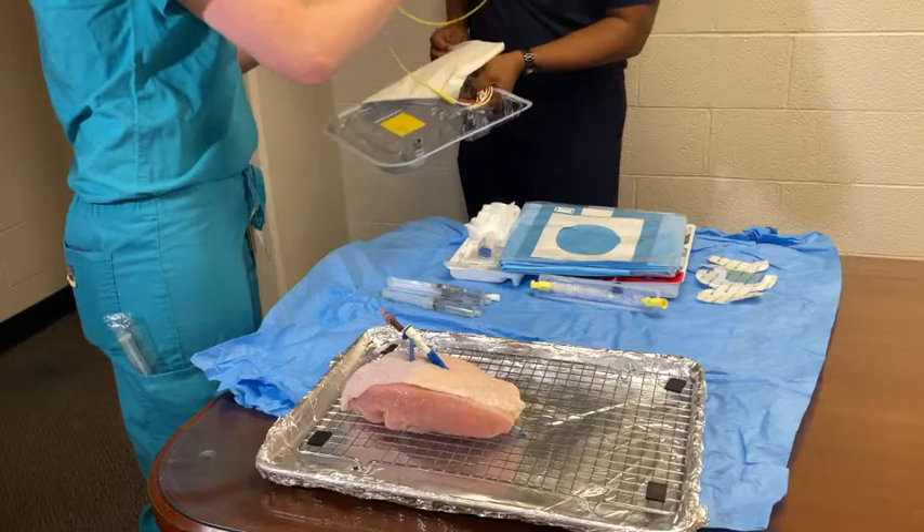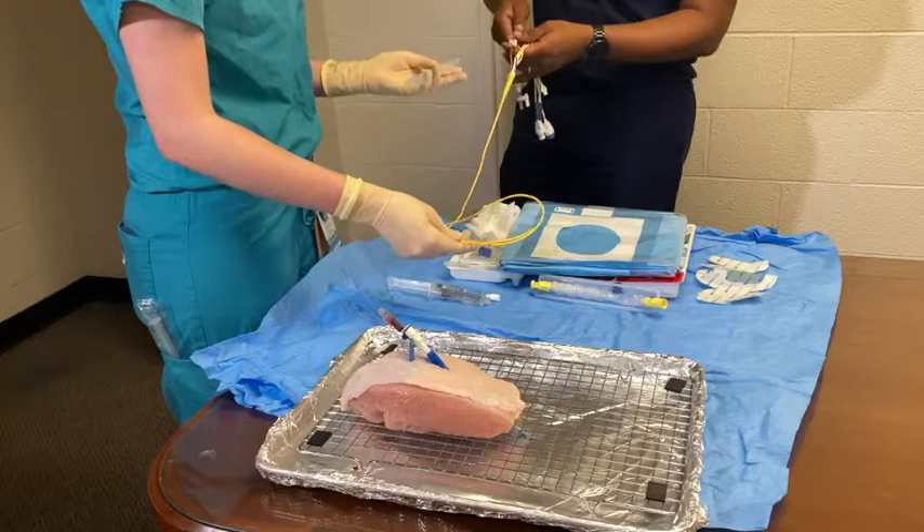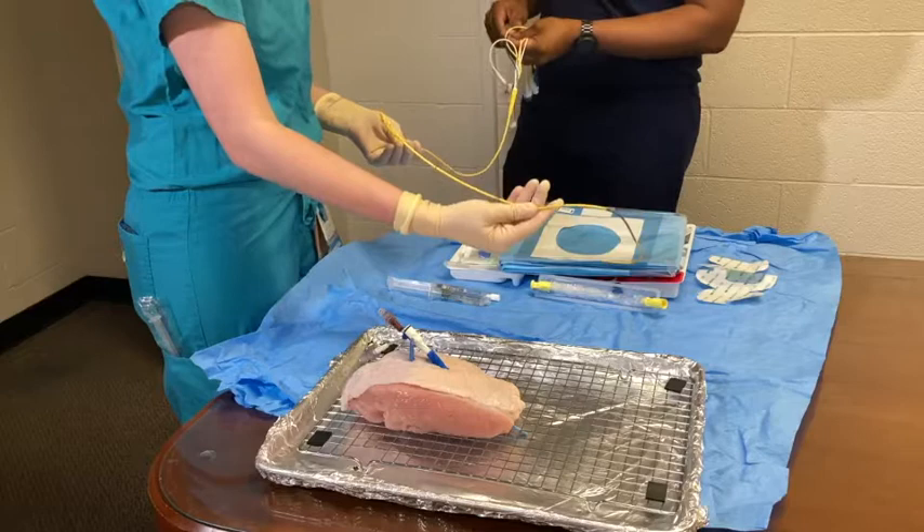While you remain sterile, your attending will help pass you the pulmonary artery catheter. Pull the PA catheter from the packaging onto your sterile field. Prior to placement, you will need to check the PA catheter. First, your attending will help flush each port of the catheter as shown.